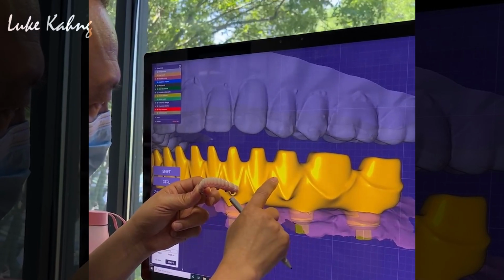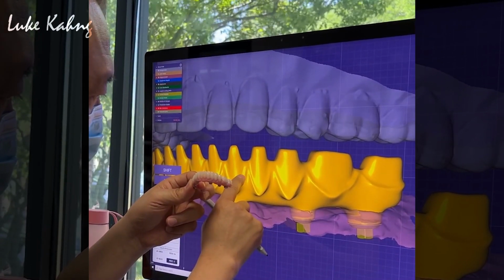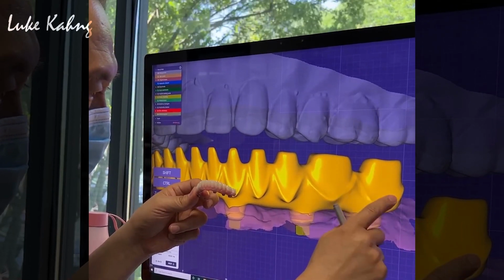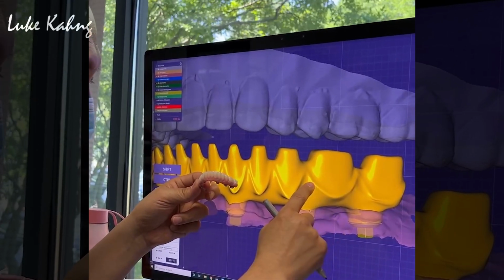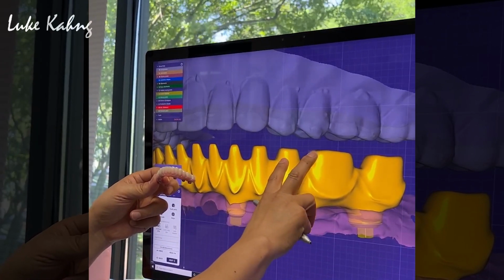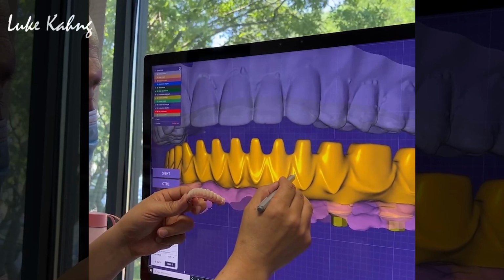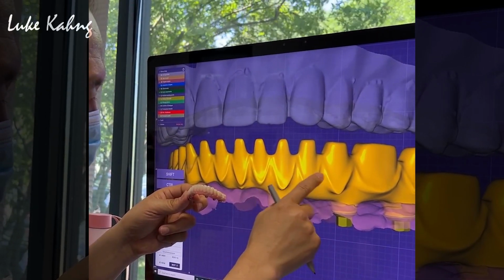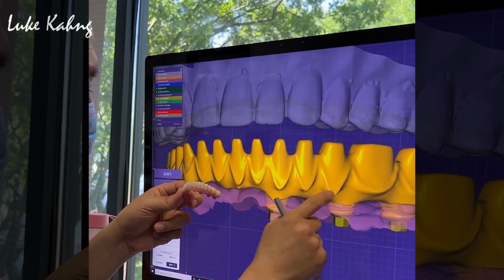So you can make it a little bit rounded. That's good. Here. Nice. Not only this, it's good for retention as well. Good. All right, change it. Move it. Pen needs a battery. All right.